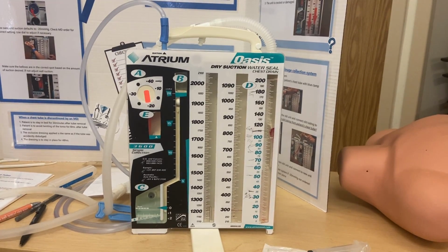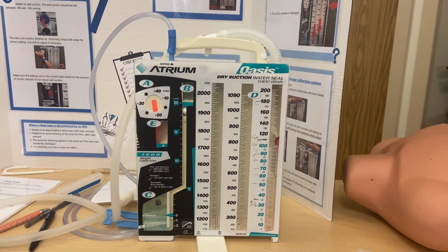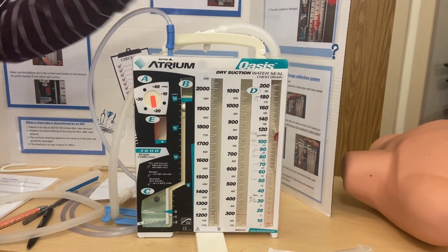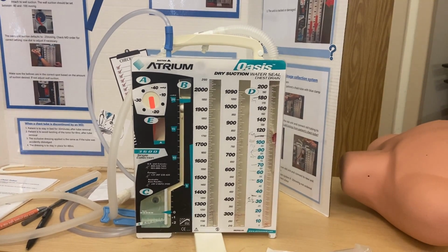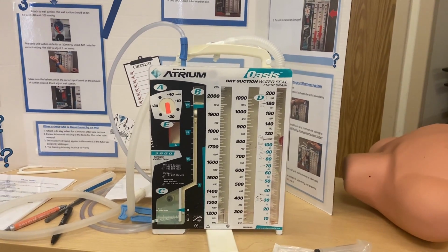Let's see, something else. If you're going to transport the patient somewhere, make sure you have an order for transport. Make sure there's an order to take it off wall suction if it's connected to wall suction. And you always want to keep this below the level of the patient's chest. I mean, everything else, you're just going to kind of monitor it. They should have chest x-rays every day.